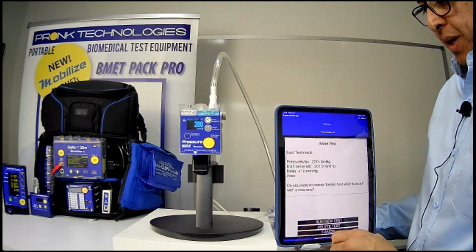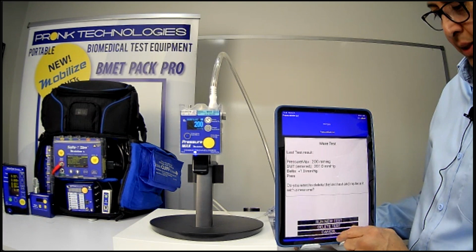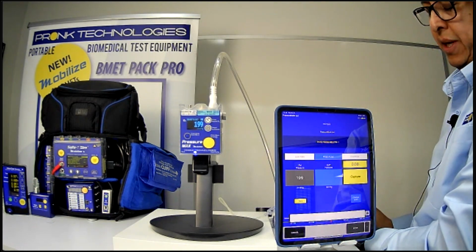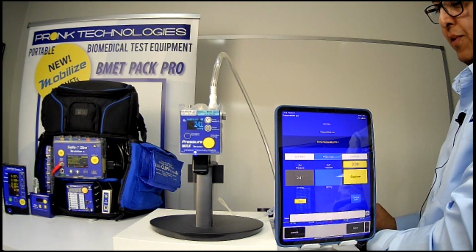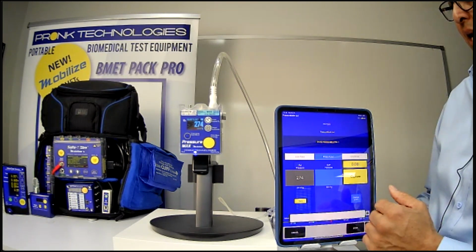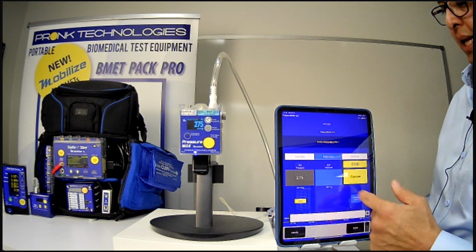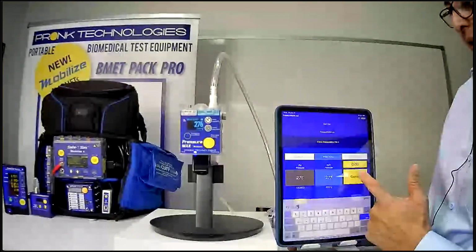Okay. So we want to go ahead and run a new test, or you can delete the test. We're just going to go ahead and run a second test. And the second test allows us just to inflate maybe to a different pressure point and make sure that our second test point is within our calibration as well. So I'm just going to go ahead and inflate to 275 and make sure we're within that test point. So we're going to go ahead and turn this just a little bit more. And then on the medical device, of course, again, you capture that result to make sure it's within tolerance.